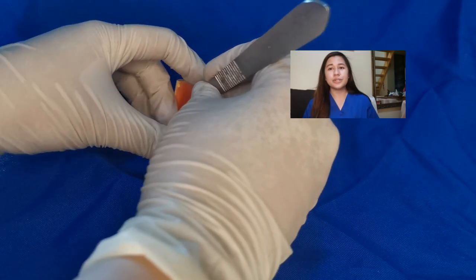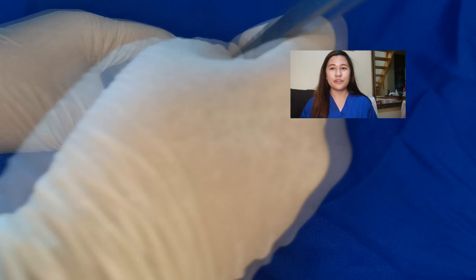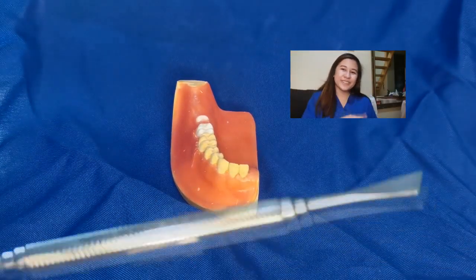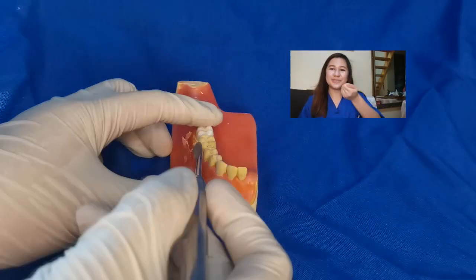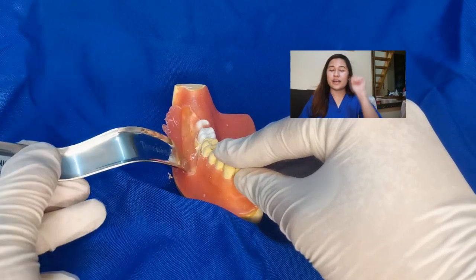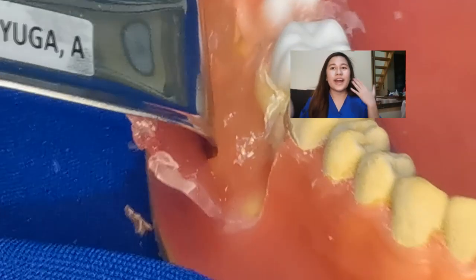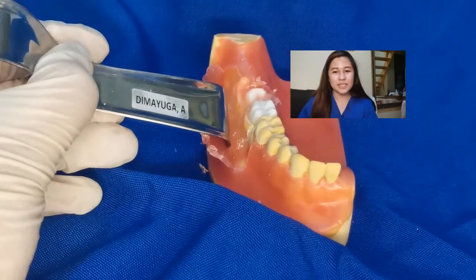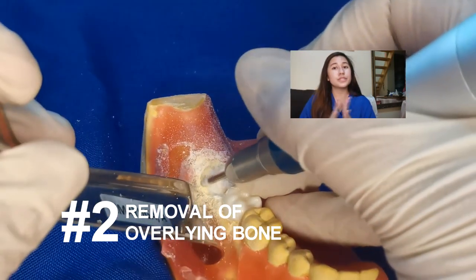We will use our elevator to reflect the flap, and we will use our Minnesota retractor to retract the flap, and you will have full access to our impacted tooth. Number two: what our professor taught us is that we should not do the saucer method right away for removing overlying bone.